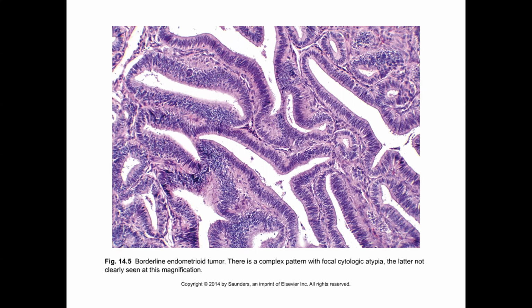So here's an example of what this might look like. You can see a more complex pattern, still fairly well organized and columnar cells without a lot of crowding or pseudostratification. But the glands are crowded. The glands are close together, and there is some nuclear enlargement here that would go along with the picture of either endometrial atypical hyperplasia, or in the ovary, we would call this a borderline tumor.